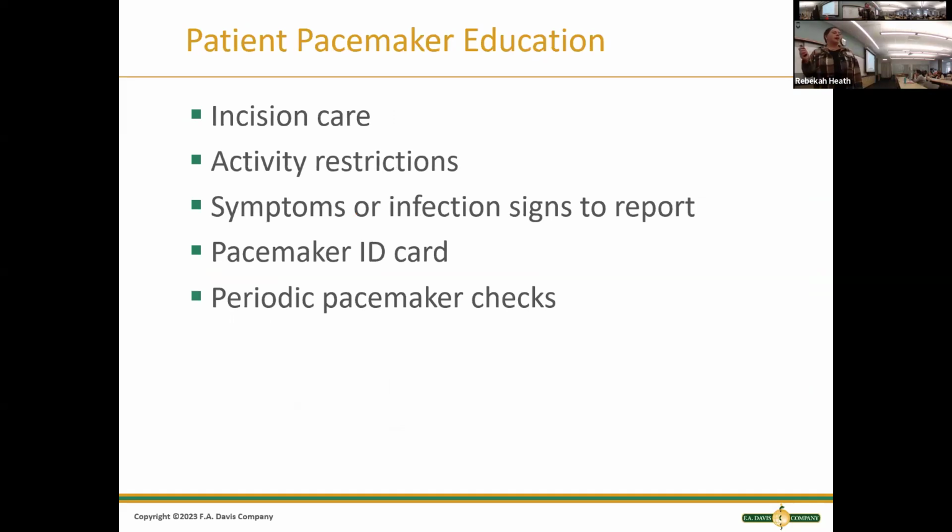One thing with our patients when they have pacemakers, we want to make sure they know what to monitor for, right? If they start not feeling well, they want to make sure they know how to count their own pulse because it might not be working. We want to make sure they know how to monitor for infection after they've had it put in, right? Monitor that site. You know what to look for, signs of systemic infection. Make sure they know what kind of pacemaker they have.